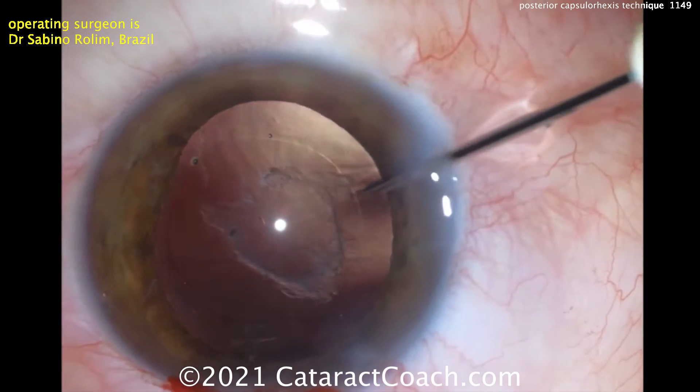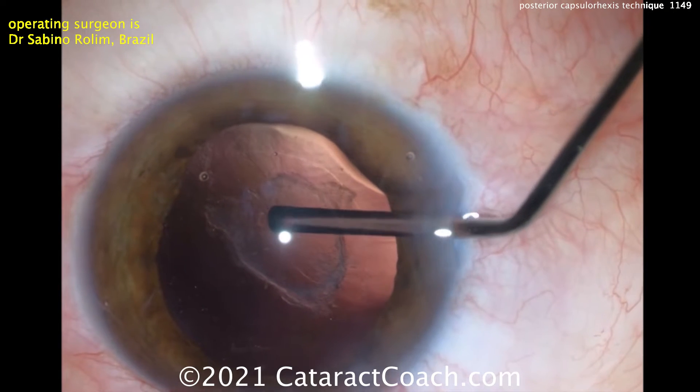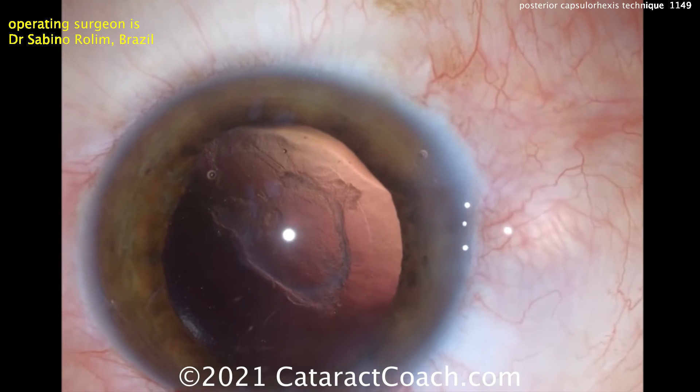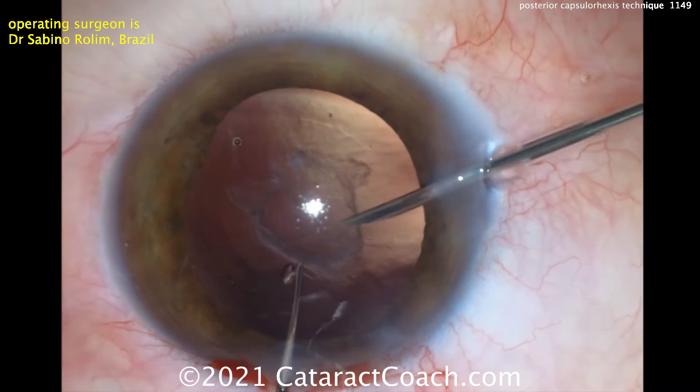First, poking in with a sharp needle to try to start it. Then, importantly, injecting some dispersive viscoelastic — a small amount — to separate the anterior hyaloid face from the posterior capsule, from the back side of the posterior capsule.